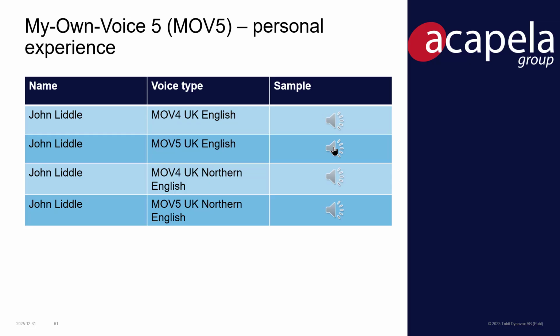Now, that's a great improvement in terms of the quality of the voice, but it doesn't actually sound like me in terms of how it would say grass and bus and things like that. So let's listen to the My Own Voice for Northern English.